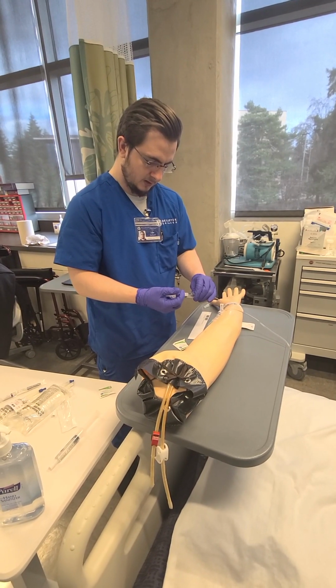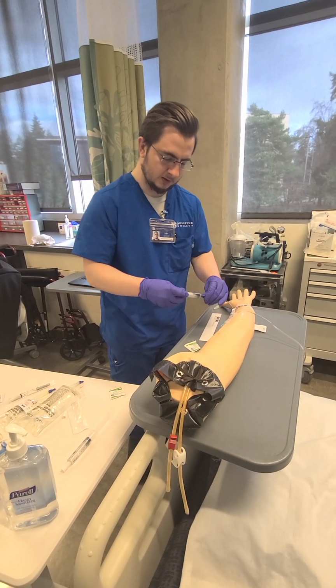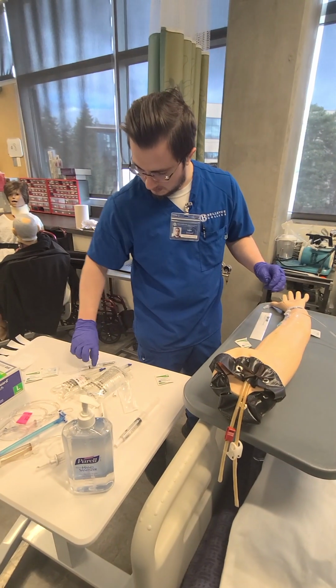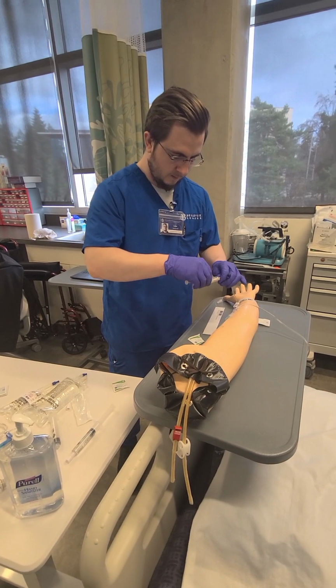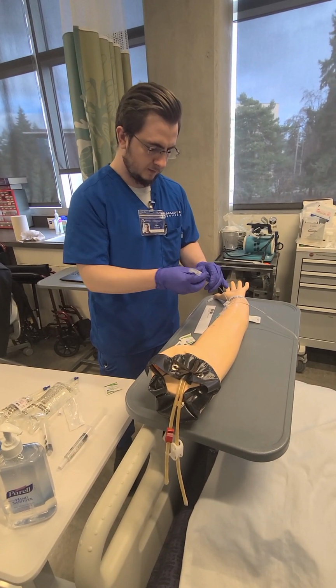Flush the line, make sure it's patent. It is. Everything seems to be working. There's no edema, swelling, redness, infiltration, etc. Then I get out my Zofran. Cool. I just flushed it, so we're good.